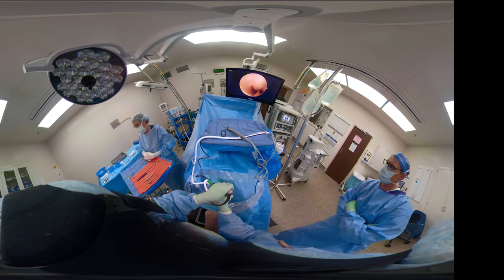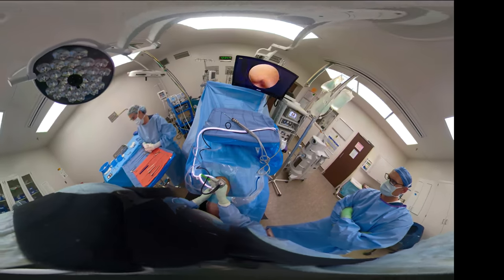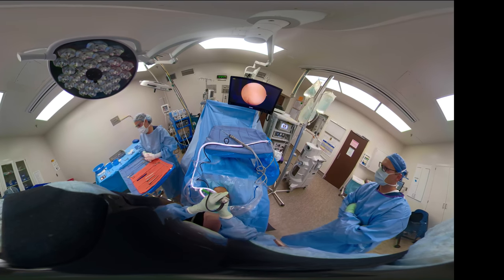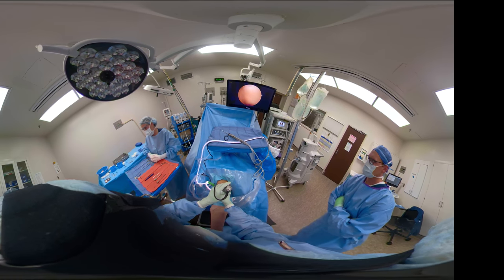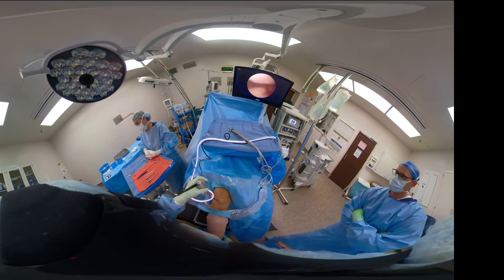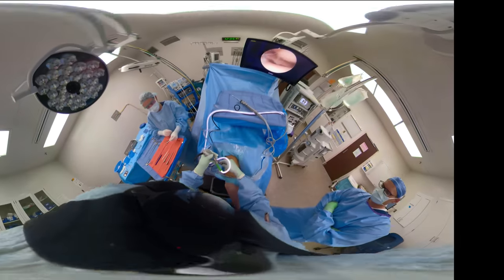The popliteus tendon is up at the 1 o'clock position. You can see where the light source is, there's a little V there where it's looking in that direction. So I'm looking to the right now at a 90 degree angle, at 3 o'clock. And then you can also look down to see if there are any loose bodies, which there are no further loose bodies. And now I've got the knee going into a varus position.